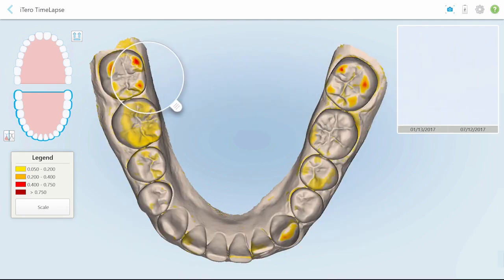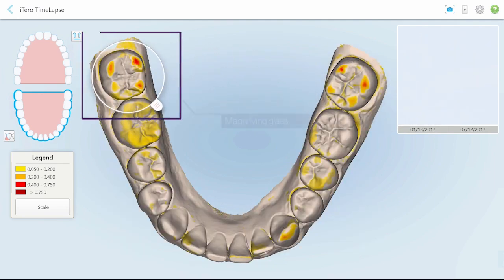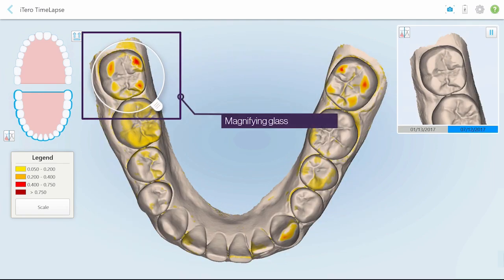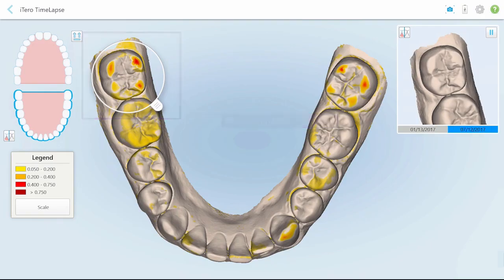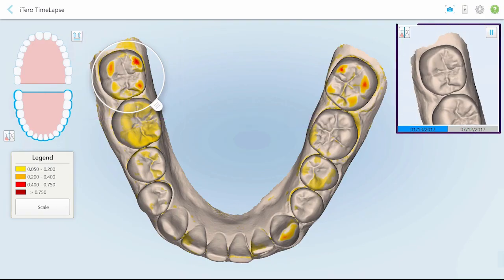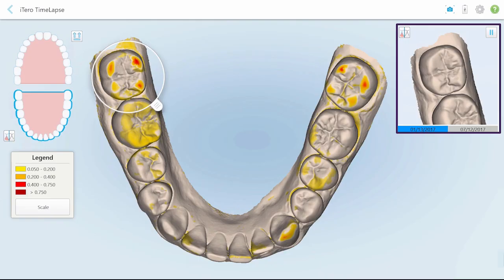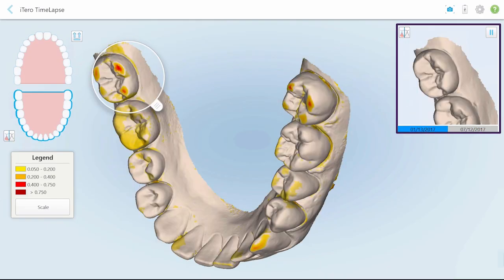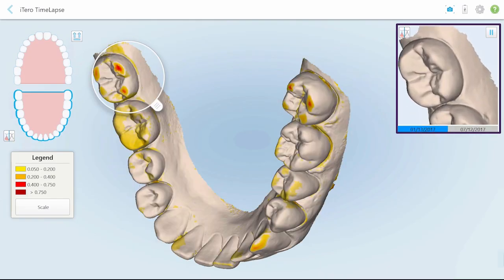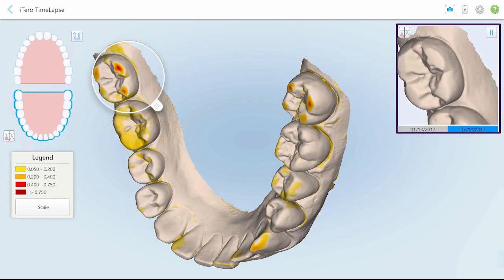Drag the magnifying glass to focus and assess change in a specific area. The circled area will appear as an animation in the top right corner and alternates between the two selected scans to demonstrate the detected differences.